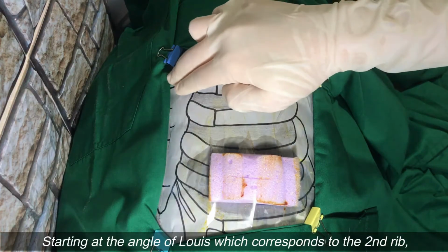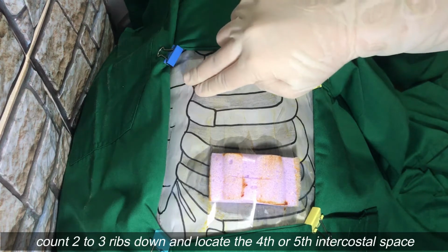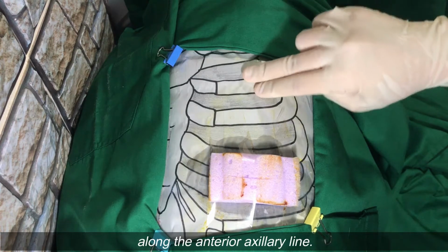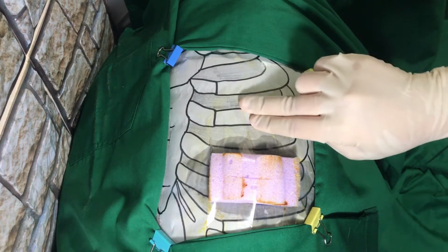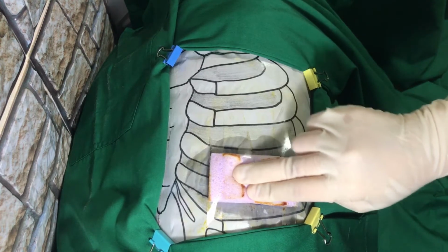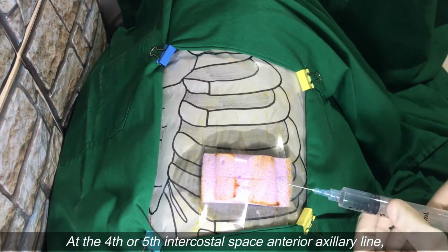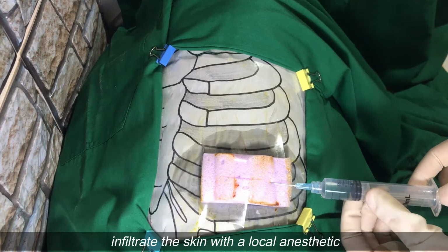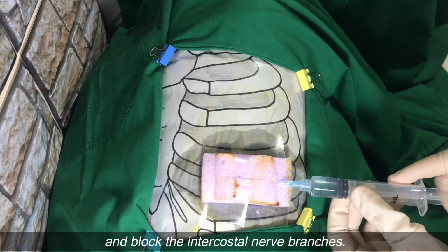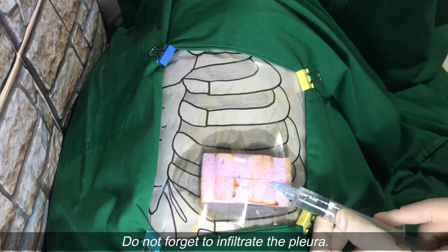Starting at the angle of Louis, which corresponds to the second rib, count 2 to 3 ribs down and locate the 4th or 5th intercostal space along the anterior axillary line. At the 4th or 5th intercostal space anterior axillary line, infiltrate the skin with a local anesthetic and block the intercostal nerve branches. Do not forget to infiltrate the pleura.